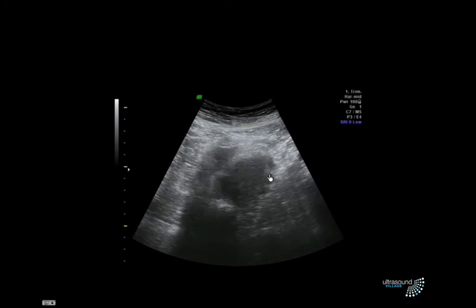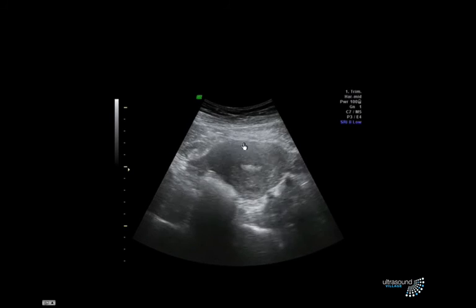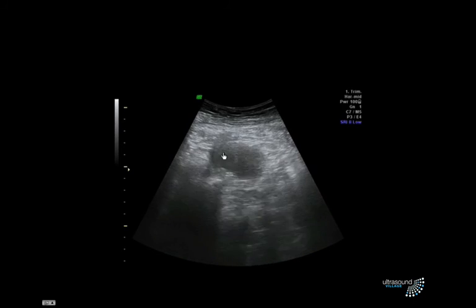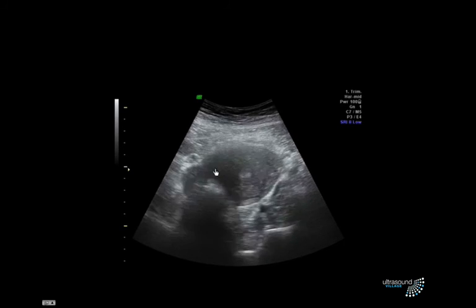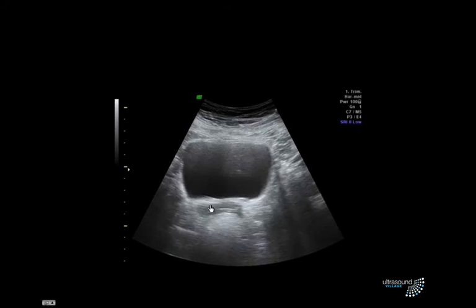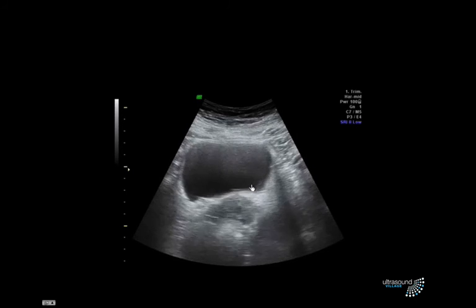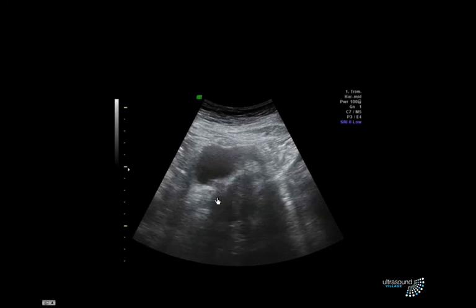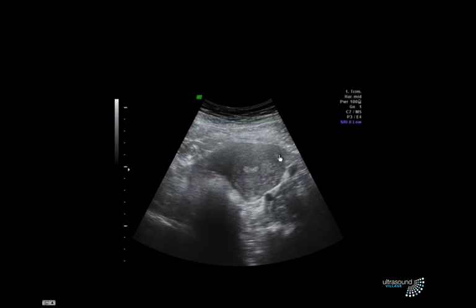We start at the top, right here. We've got the round uterus. Here it is. The endometrium comes in. We fan down through the fundus, down, down, down through the cervix, here and into the vagina. Here's vaginal stripe. There's urethra. Here's bladder. We saw ureteric orifices there just for a second, and now we're fanning back up again through the cervix, back up to the uterus.